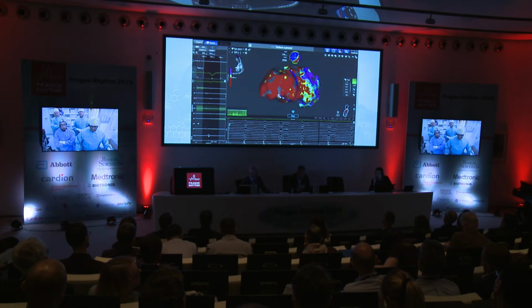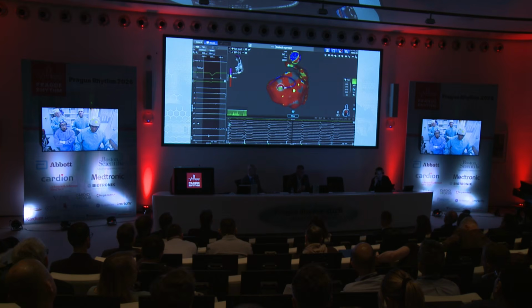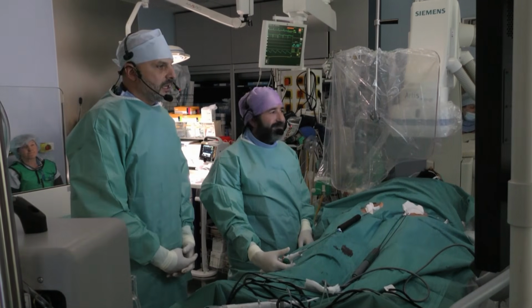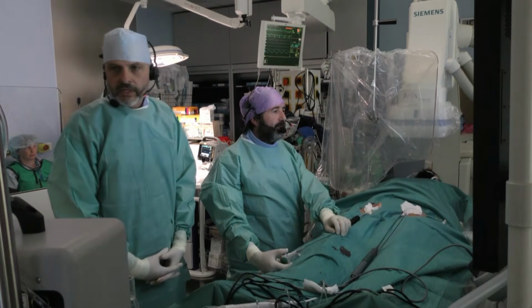Yeah, definitely, Vivek. We switch to the ICAM room. Okay, fantastic. See you. Hello, hopefully you can see us, yes? We can see you. So we are in ICAM doing a VT case, and let me first clinically introduce the patient.